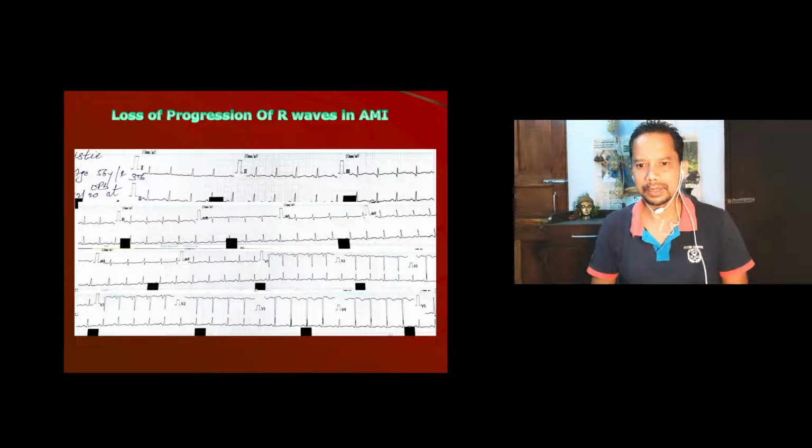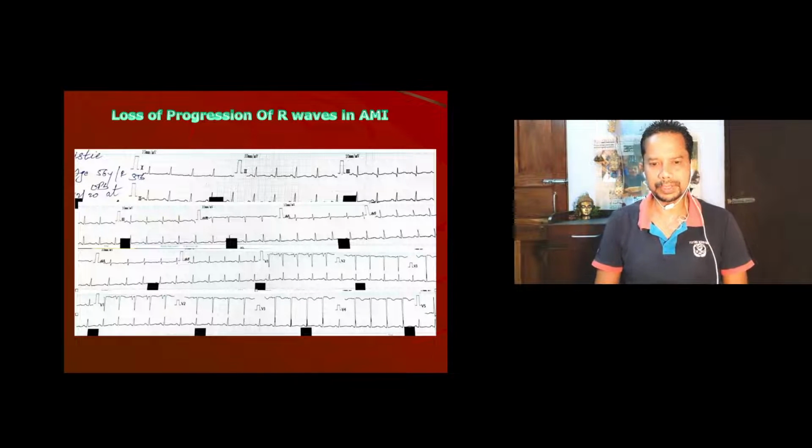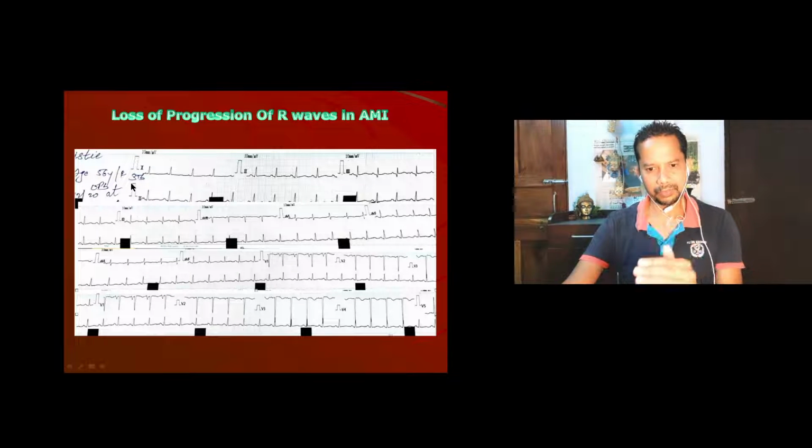Now this is a very nice ECG of one of our patients. Just look at this, spend some time on this ECG. I have taken different ECGs at different times, the same day after few hour intervals. So this was the first ECG taken, then second ECG, then third ECG, then fourth ECG.